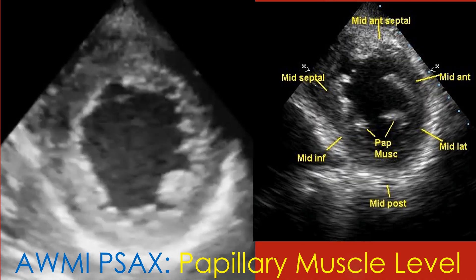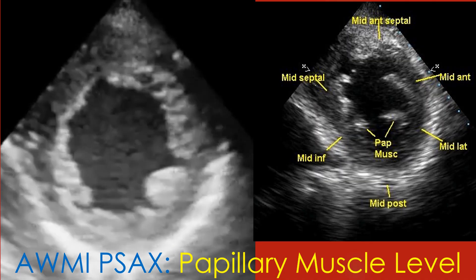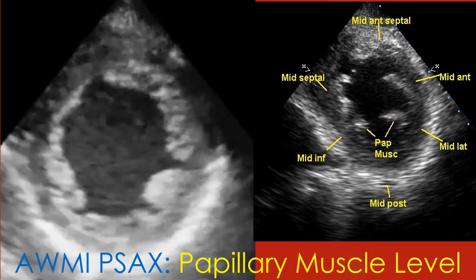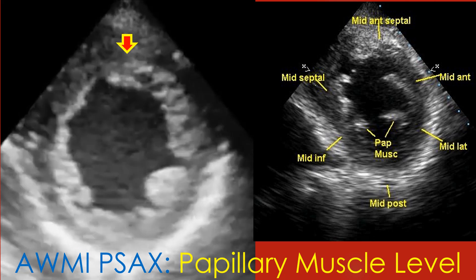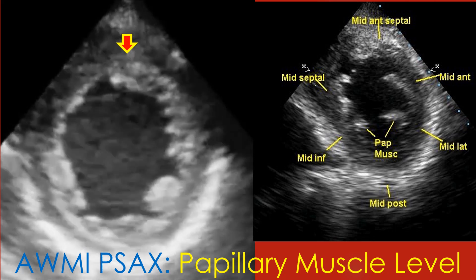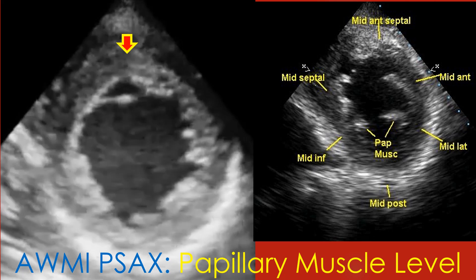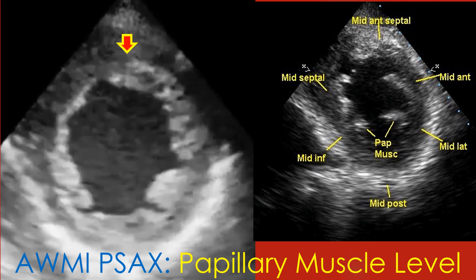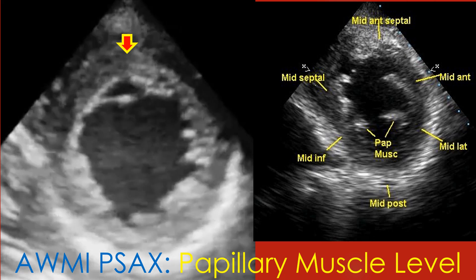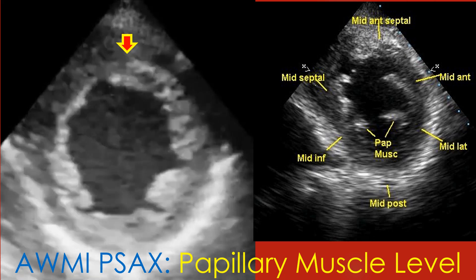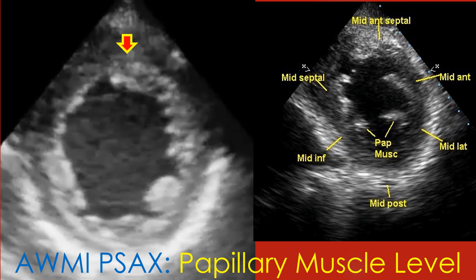Parasternal short axis view at the papillary muscle level showing mid anteroseptal hypokinesia. Other segments at this level are mid septal, mid anterior, mid lateral, mid posterior, and mid inferior.